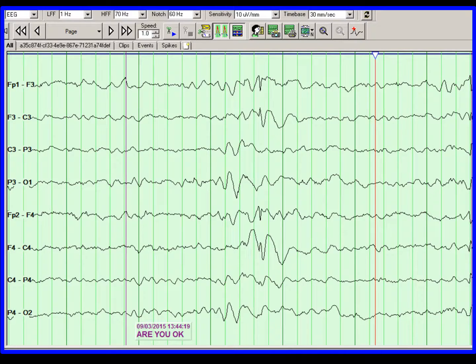This frame shows an epoch of an electroencephalogram. An epoch in EEG lingo refers to a segment of time, let's say as it is in this frame 6.6 seconds or more commonly 10 seconds, chosen by the electroencephalographer as the unit of time to partition the entire record for reviewing and description.